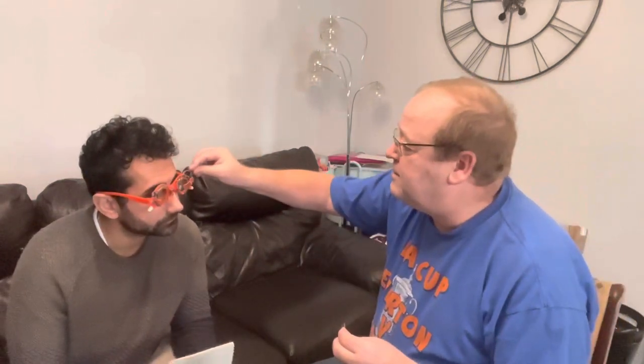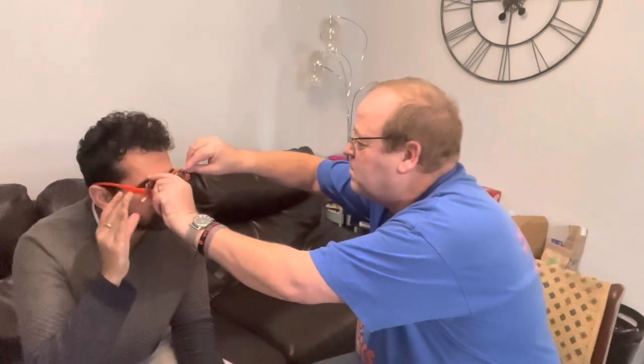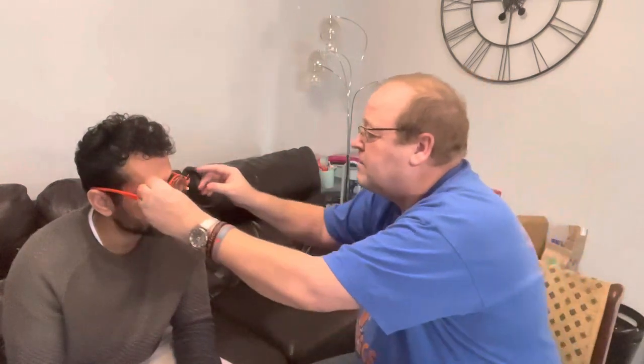I think through my left eye it's clearer. The right eye N8, the left. You wouldn't normally read with just one eye either, would you? No. I think with the two, just about N6 — X6. So let's try and bring it just a little bit closer for you, because I think we've got just a fraction too strong for you at the moment. So I'm just going to put in minus 025. Does that make it any easier? Yes, it's less strain as well.